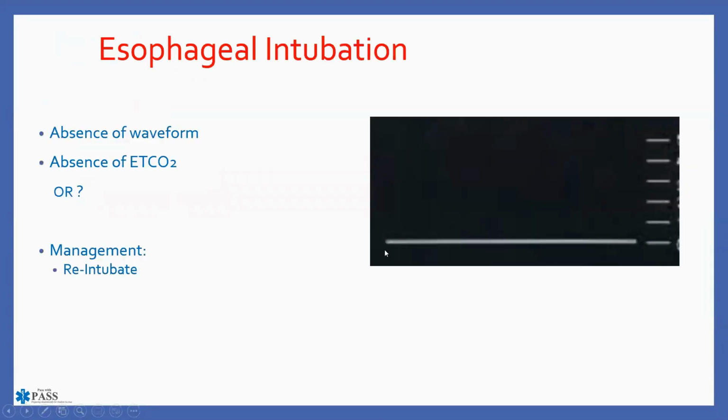If you intubate the patient and you never get that waveform in order for you to lose it, then you're probably dealing with an esophageal intubation. Remember, somebody told me this a long time ago, the lungs don't puke and the belly doesn't breathe. And that is a fact. In the lungs, if you have an intubation and there's tube vomitus coming through your tube, yeah, it's possible that they've aspirated, but under normal conditions, you should not get any type of vomitus through an endotracheal tube. If you are in fact in the lungs and the patient has not aspirated, there should be that little sidebar. And the belly doesn't breathe.